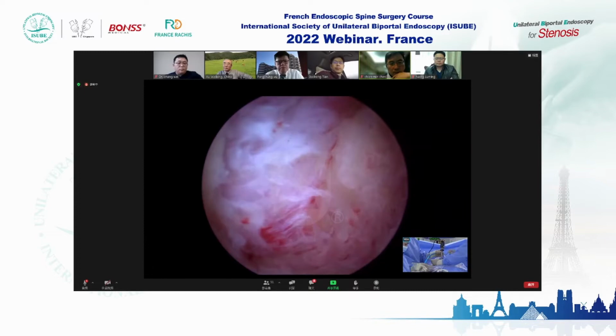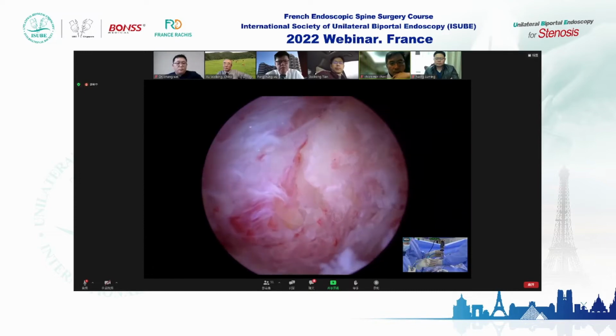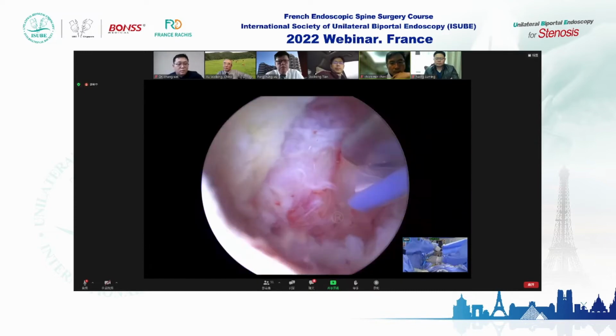Okay. I always keep the hemorrhagic line.